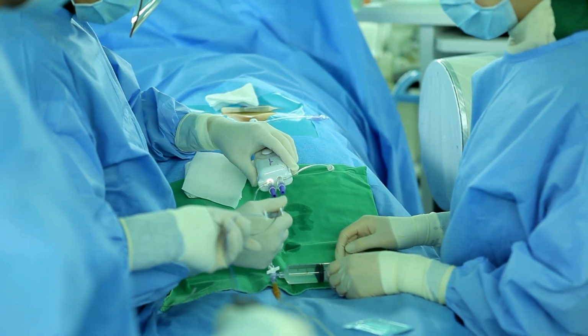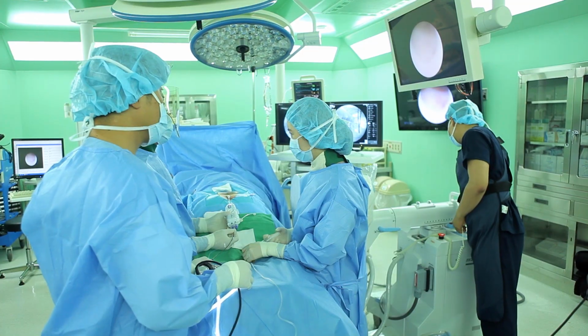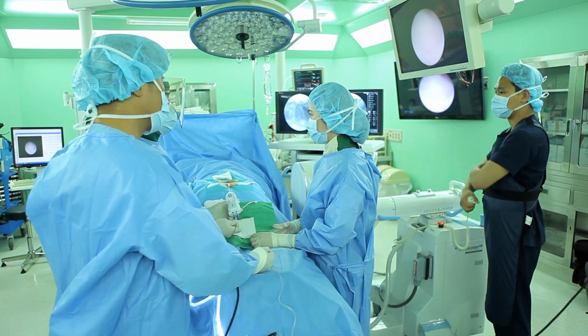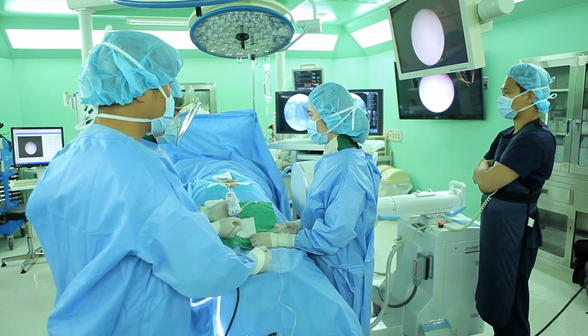Now, it's time to insert the endoscopic cable through the catheter to secure the view. There are some cases in which you can't see clearly through the endoscopic cable at the beginning of the procedure. In this situation, how can you solve this problem?